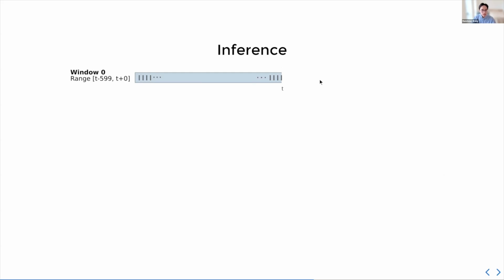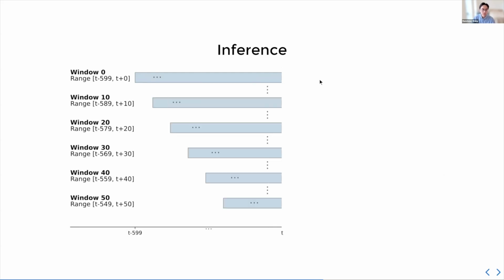Now let's leap into the future a little bit and look at the next 50 time steps of windows. Because it's an online streaming setup, each of them has some overlap with one another. Say you're trying to predict the intent at t, and you open your hand right at the moment where t happened, so all the time steps before that are relaxed.